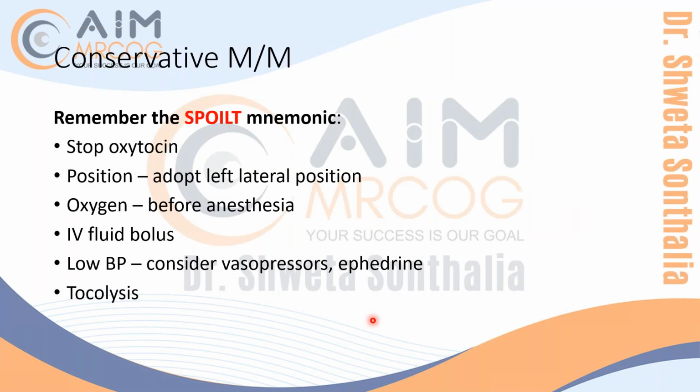Okay, so whenever you get any abnormal CTG, how do you remember what to do, the conservative measures? You can remember it by a mnemonic, if you are a fan of mnemonics. Otherwise, it's simple. Stop the stimulation, change her to left lateral position, give her oxygen only before anesthesia. Oxygen has no role in fetal resuscitation, maternal oxygen, so don't give that. It doesn't make any difference. IV fluid bolus if she's hypotensive. Low BP, you might even consider vasopressors, and tocolysis if the CTG trace is abnormal.